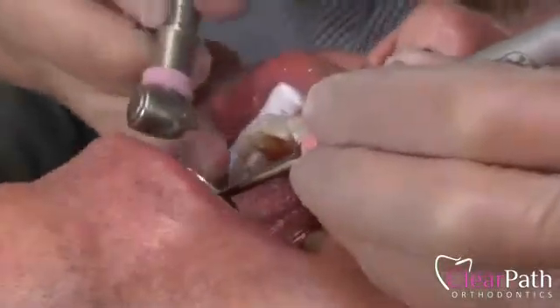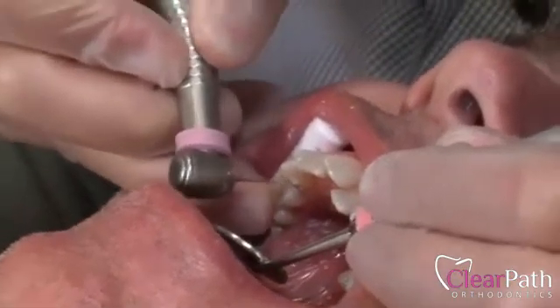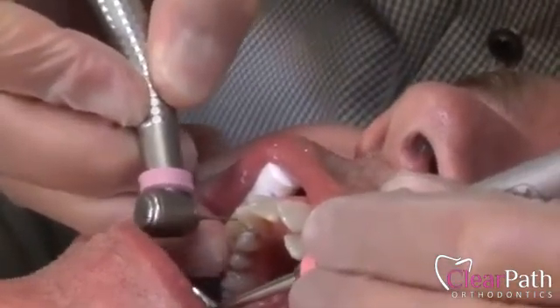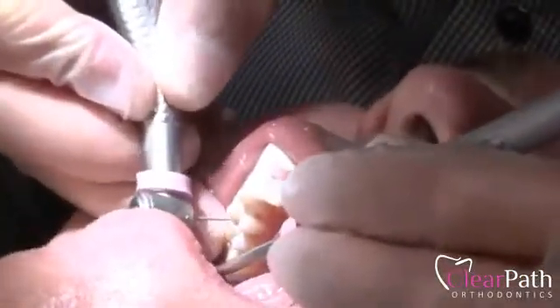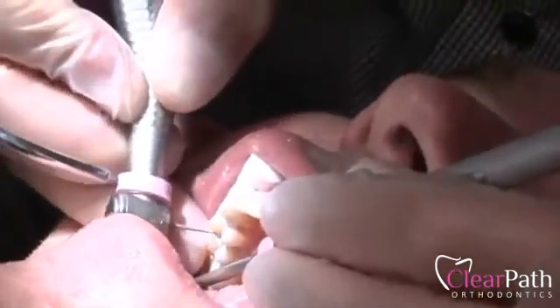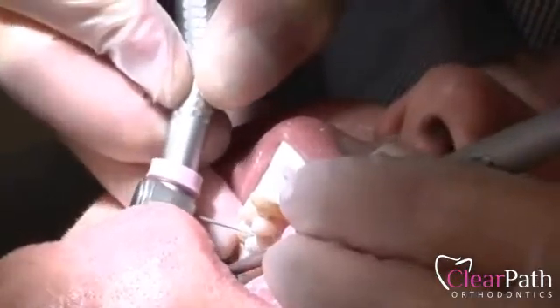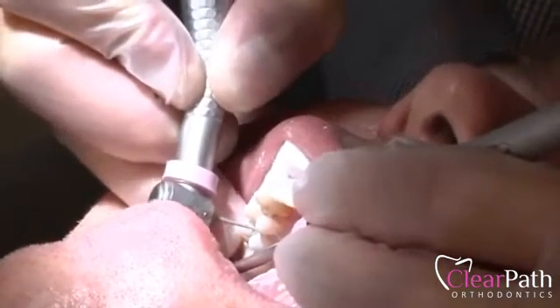We'll go between the teeth and make the appropriate amount of space. I'm just taking care to keep above the gum tissue, so it's comfortable for the patient.